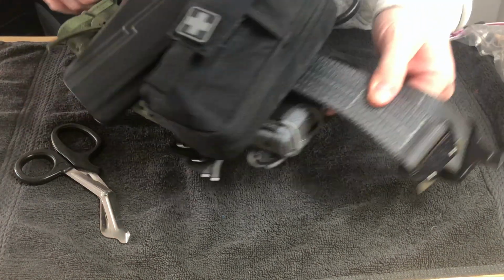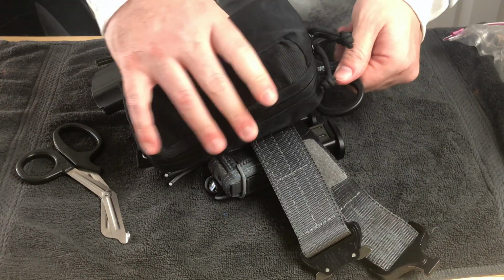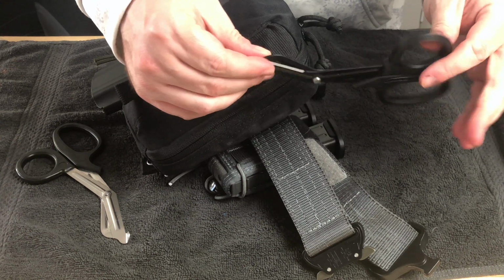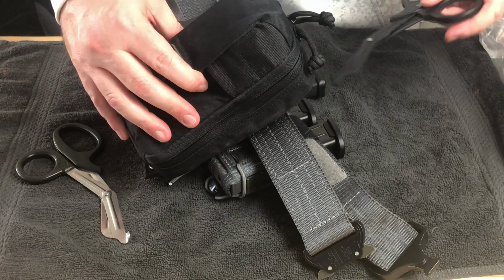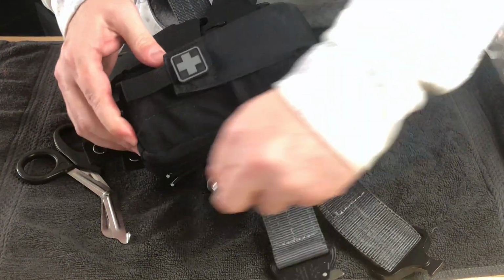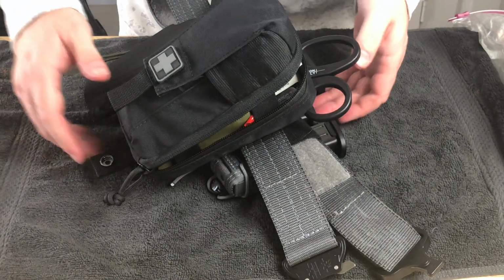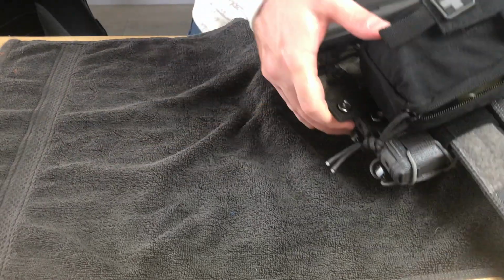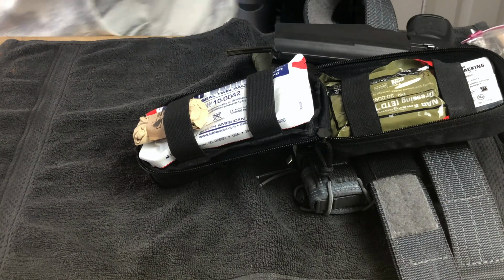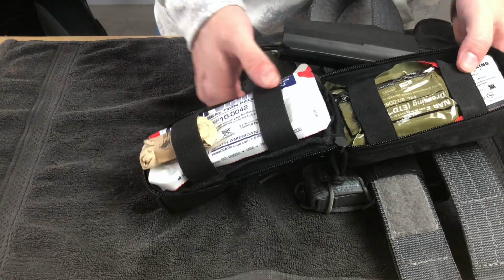Scissors back here. Nothing special, just standard scissors. However, the reason I included this kit in this video is because it's a good example of the bare minimum trauma. Let's slide this over a little bit.